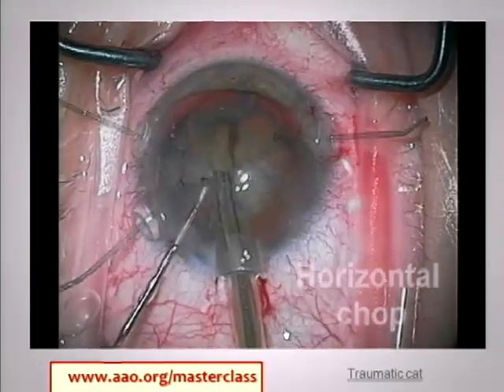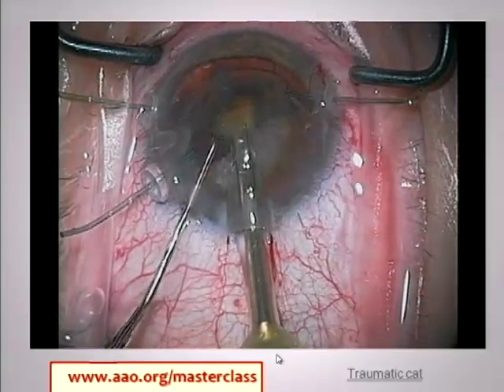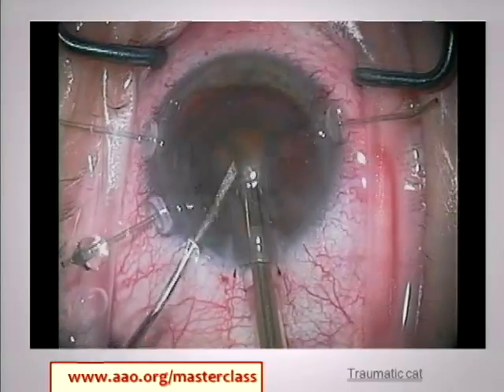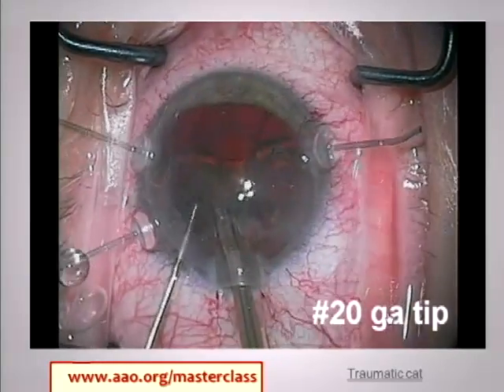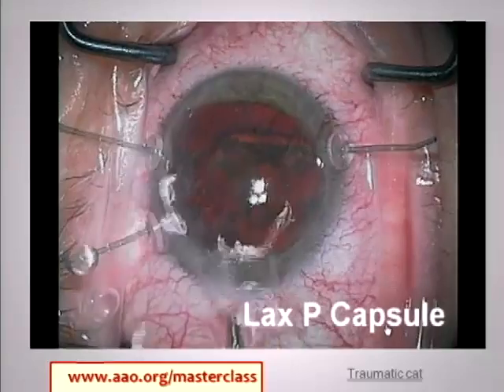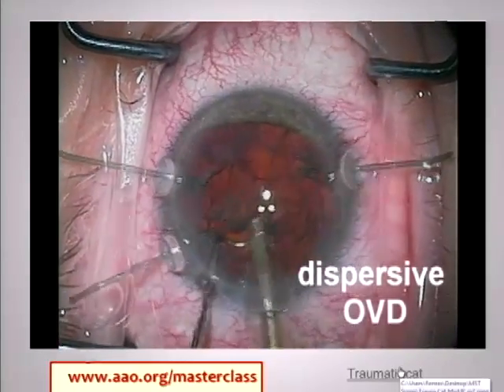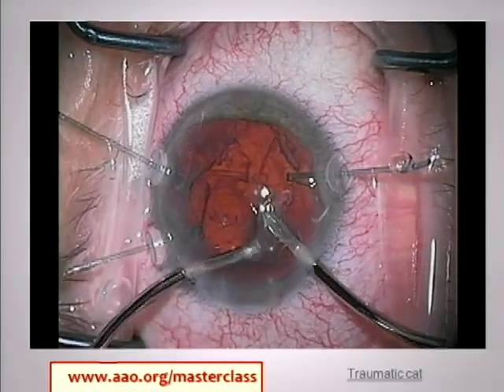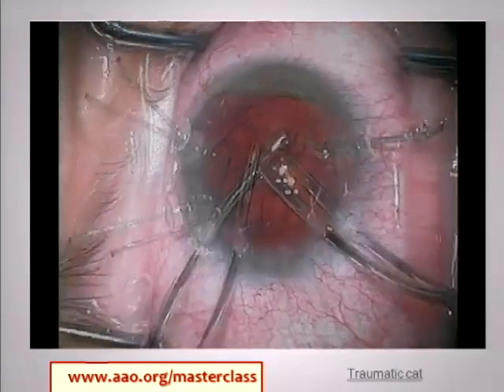This is absolutely essential for these weak zonule cases: you're getting rotational stability, you're getting support in the AP direction, and that's very important when you're doing the phaco. It's also keeping the bag from wanting to collapse in toward the phaco tip, where in essence you end up aspirating the entire peripheral capsular bag. This essentially serves as artificial zonules and allows you to delay putting the CTR in until as late as possible, because putting the CTR in will tend to trap the cortex and epinucleus. The key is to repeatedly use viscote to expand the bag — either on your last piece of nucleus, the epinucleus, or cortex — because even with the retractors, you're not tensing up the posterior capsule, and without normal zonular tension, the posterior capsule is more pliant and more easily aspirated.